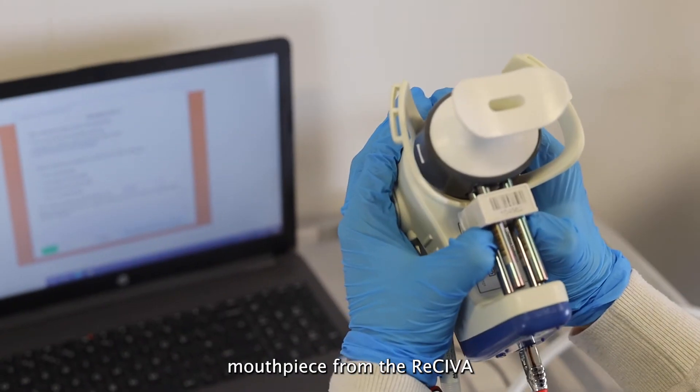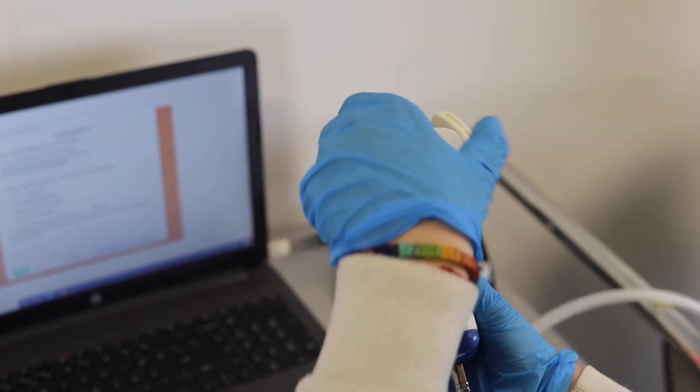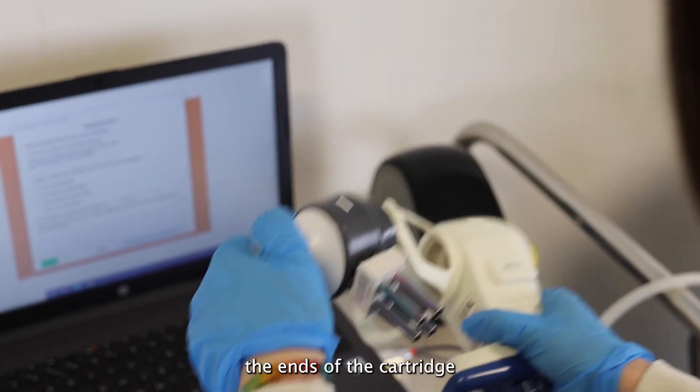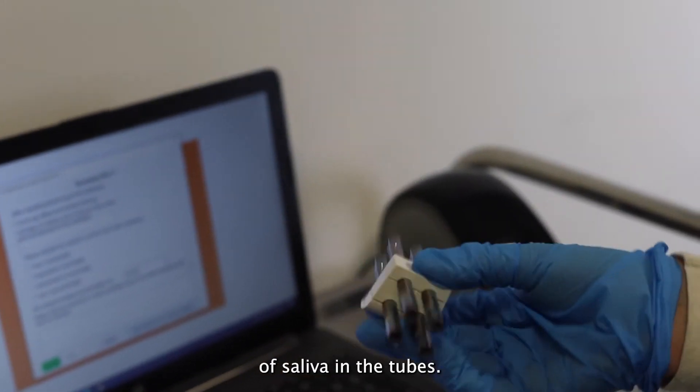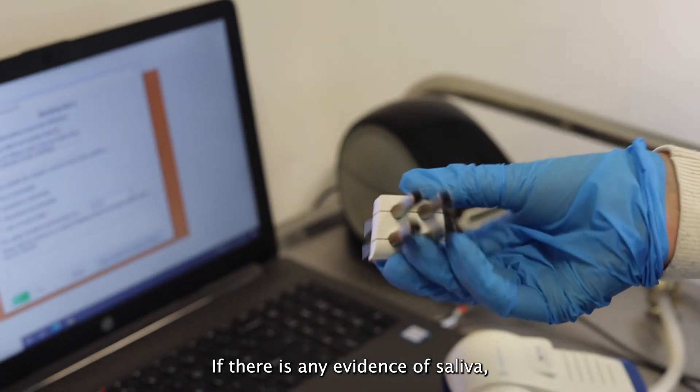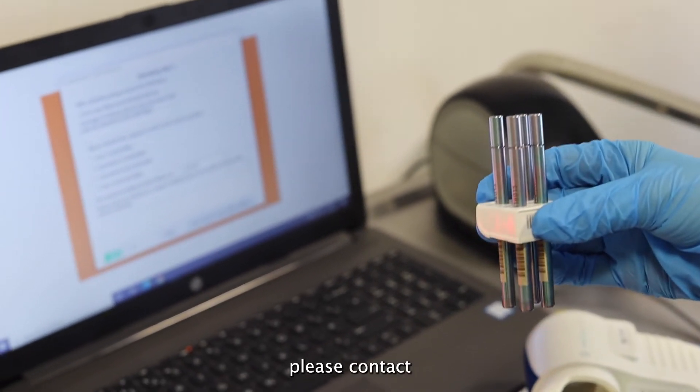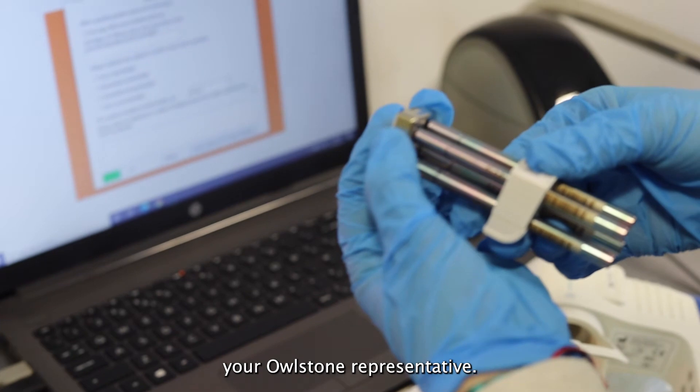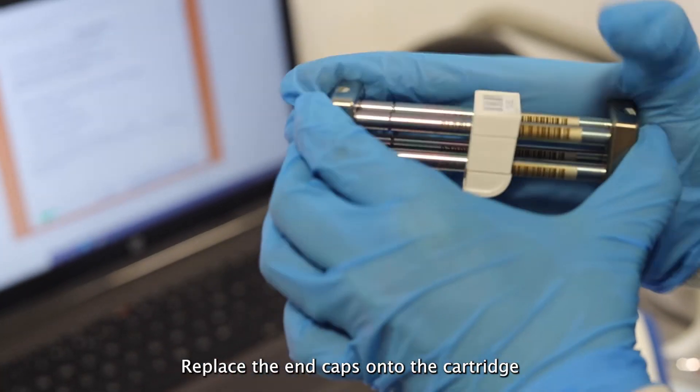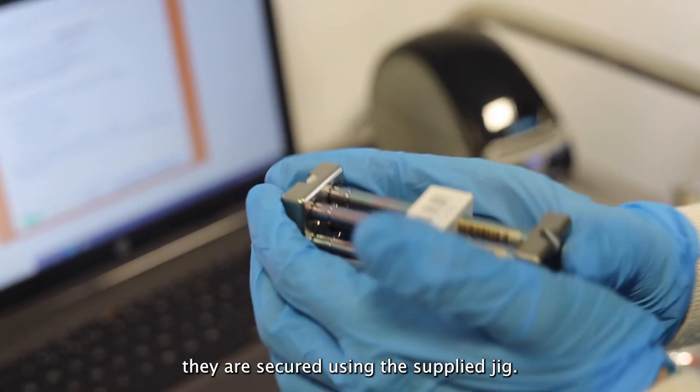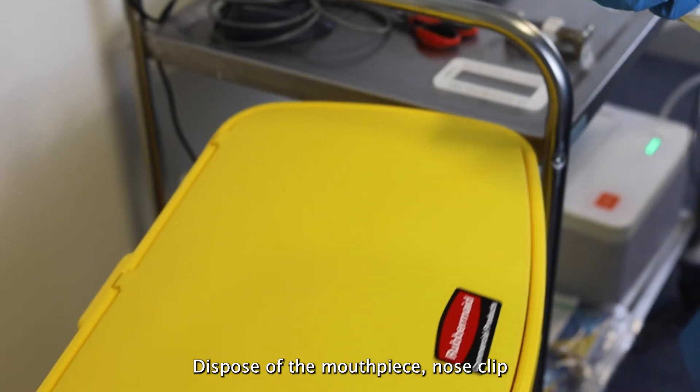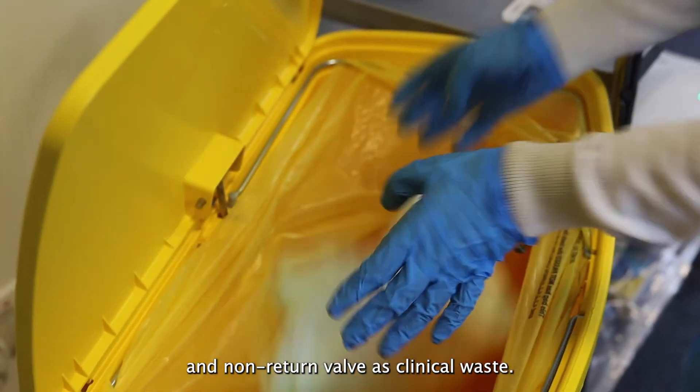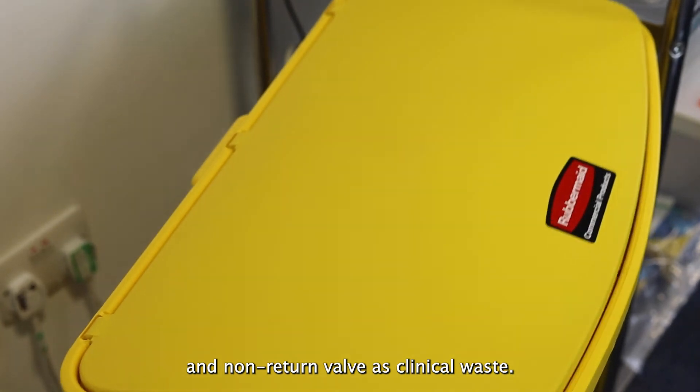Remove the cartridge and mouthpiece from the receiver and visually inspect the ends of the cartridge to see if there's evidence of saliva in the tubes. If there is any evidence of saliva, please contact your Owlstone representative. Replace the end caps onto the cartridge and check they are secured using the supplied jig. Dispose of the mouthpiece, nose clip, and non-return valve as clinical waste.